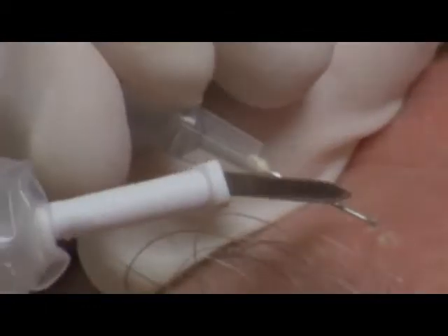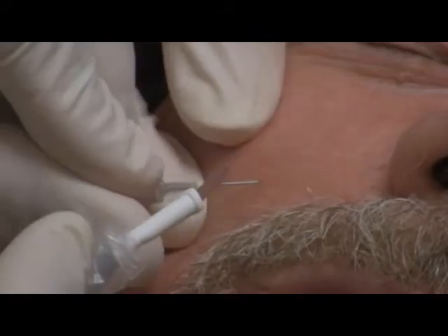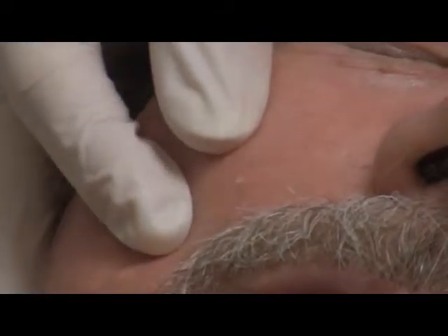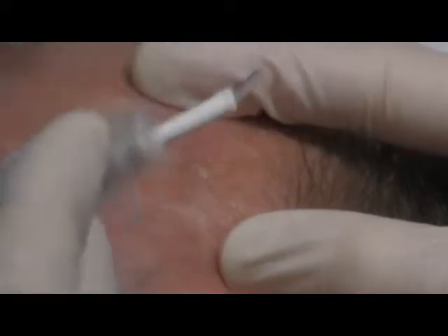Some lesions may require a second point of entry, but once tissue discoloration occurs, the electro-desiccation is complete. This procedure minimizes epidermal damage and adequately treats the sebaceous hyperplasia lesion without requiring curettage after electro-desiccation.